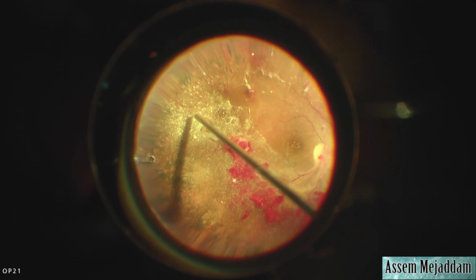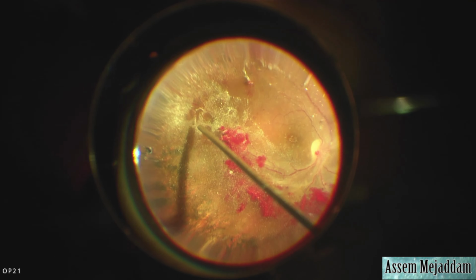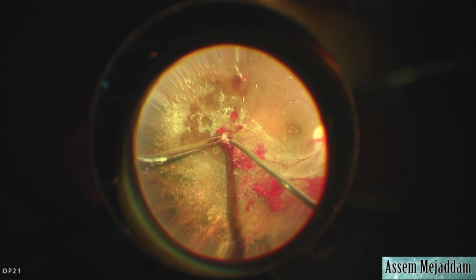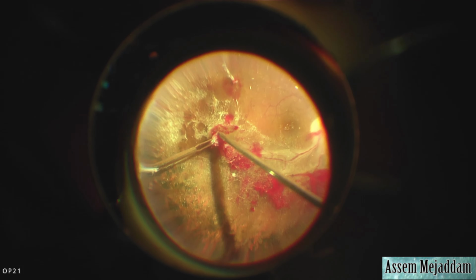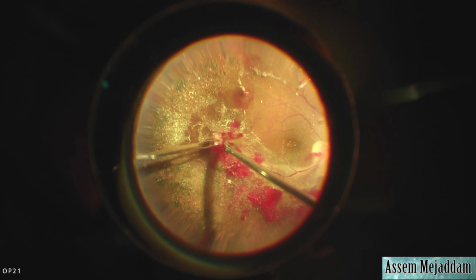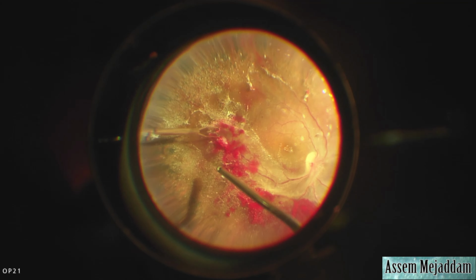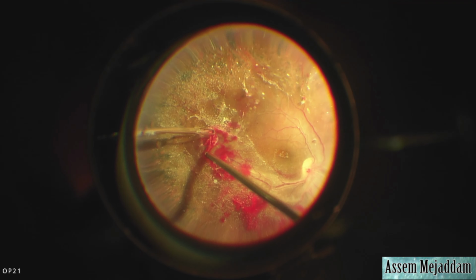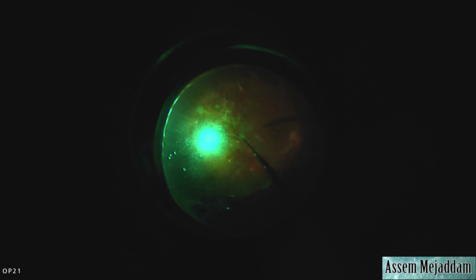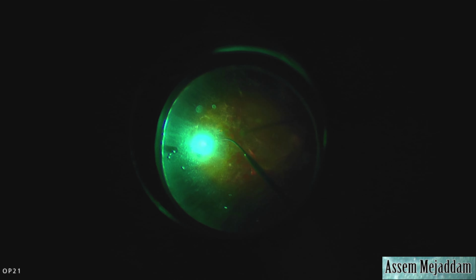I've injected triamcinolone to see if there's any vitreoschisis. Try to aspirate some of that away. Unfortunately, there's a very small hole that does occur because the retina is so extremely ischemic. And there is a small membrane which I'm forced to remove because you cannot leave any membranes anywhere close to retinal holes.